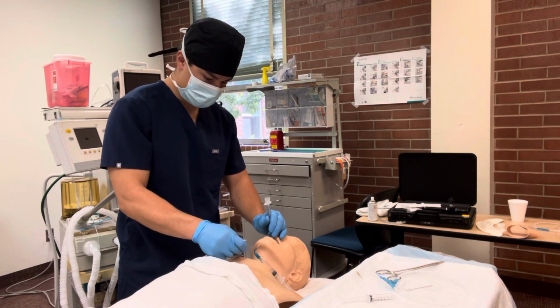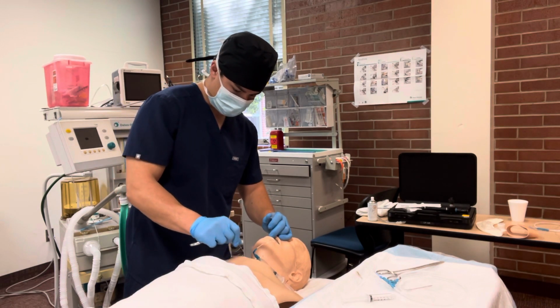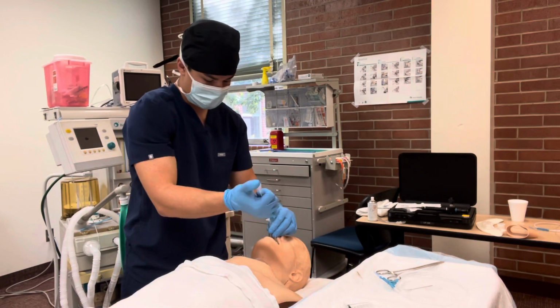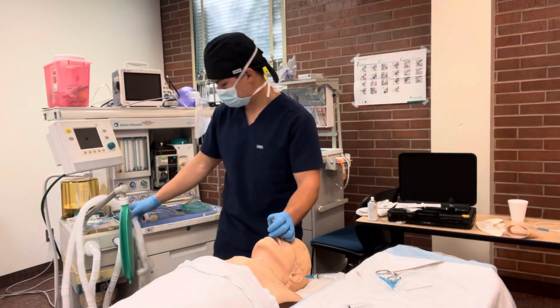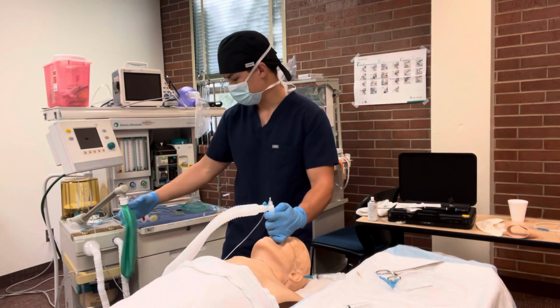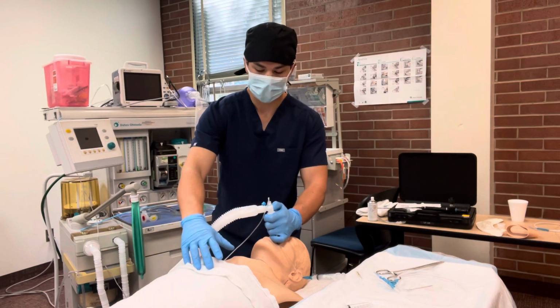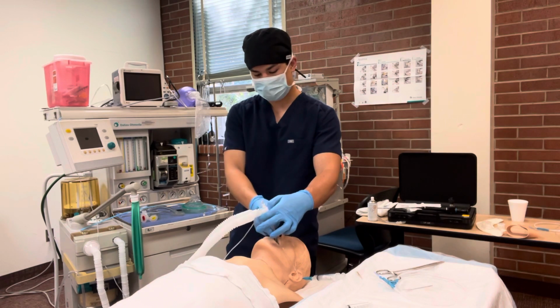And then I can pull out my wire, inflate my cuff, hook up my circuit, give some ventilations, make sure I got end-tidal CO2, SpO2 is maintaining, equal bilateral chest rise and fall, and auscultate. Maintain my patient throughout the procedure and secure my tube.